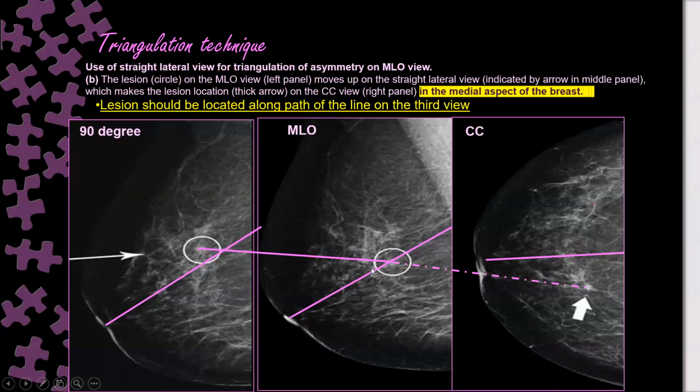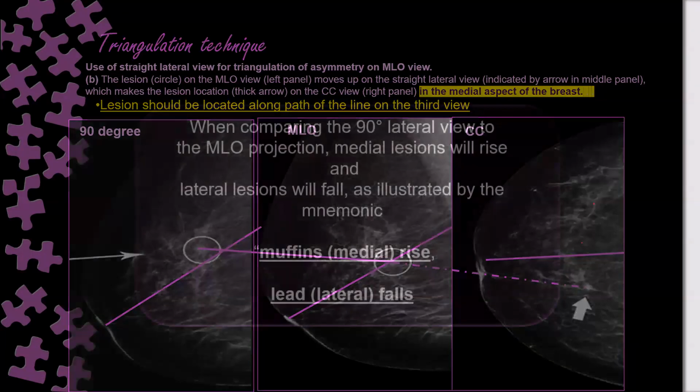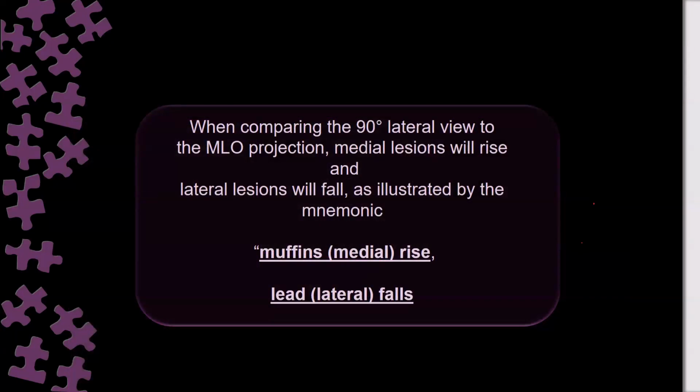Measure this distance from the nipple, and measure the same distance from the nipple on the other view, to make sure you are talking about the same lesion. Is it clear? Yes. So that is the conclusion.